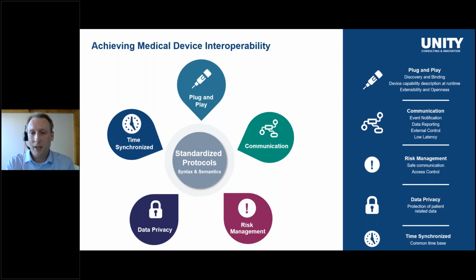From a technical standpoint, we also need different communication patterns. There are things like alarms, which only occur episodically, but there's also the general data reporting of the data stream so that we can have live waveforms, for example, and there's also external control. And of course, all related to low latency if you want to.